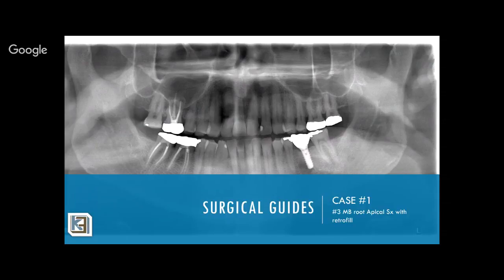Now, as you get deeper, you may start deviating sideways, so you stay centered within the tooth, but you're deflecting off the path. So that's how I ended up with the perforation in the last case. But yes, the actual internal surface of the tooth somewhat creates an internal guiding plane as well as you go deeper. Okay, those are the questions that came in currently.